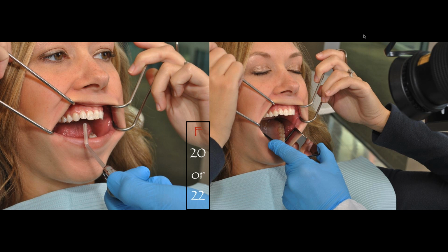Okay, now we're going to go to our occlusal shots. You see, now the patient has inverted the retractors. Now we're not using the wide part of the retractors, we're using the narrow portion of the retractors. And we ask the patient to hold only the upper lip. So we show her how to do it, just like we did for the full retracted maxillary and mandibular arch retracted photo. We kind of show her, guide her, and we have her separate the lip from the upper arch, from the maxillary arch.